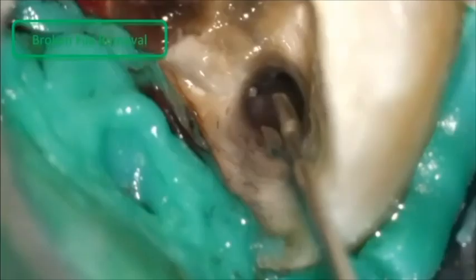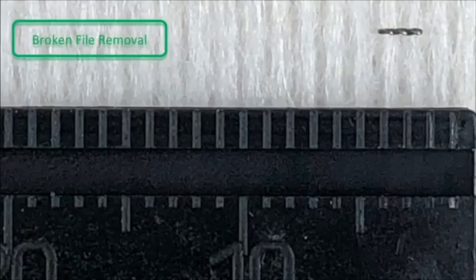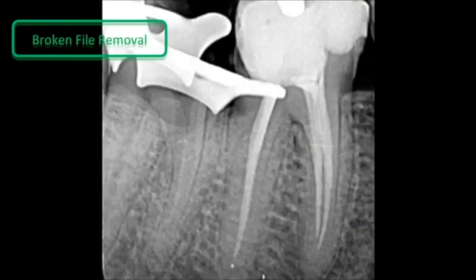Once it is at the entrance of the canal, I'm going to take the micro tweezer. And that's it. I'm catching the file. And this is the file. This is a 2 millimeter file only. So it's a very small file, at the junction of the middle third and the apical third, in a very difficult second lower molar. And this is the cone fit.